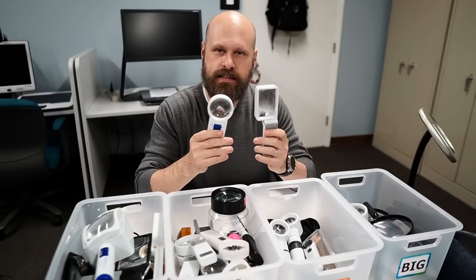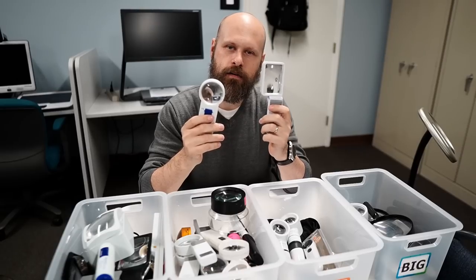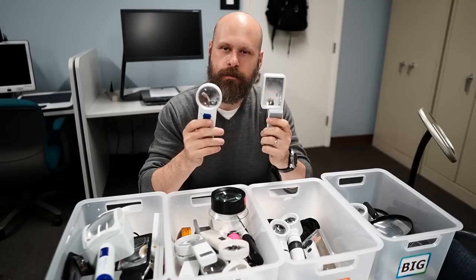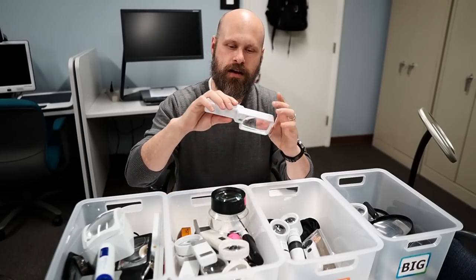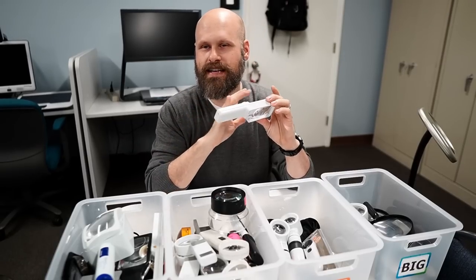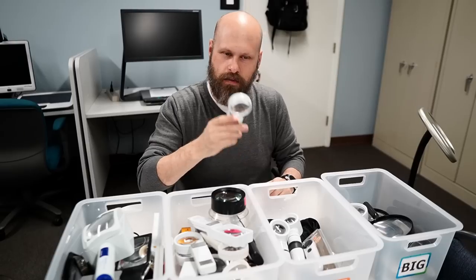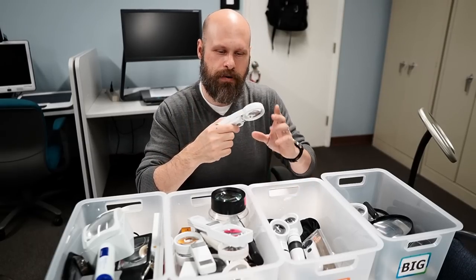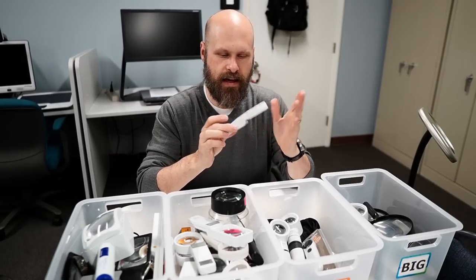Something else to consider is whether to get a round magnifier or a square or rectangle magnifier — this is also a personal preference. The rectangle magnifiers work much better for text and reading because you have a much wider field of view. The round ones tend to be more compact and fit in pockets and purses a little bit easier.